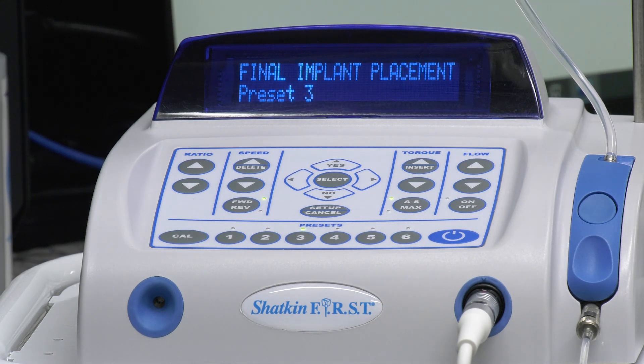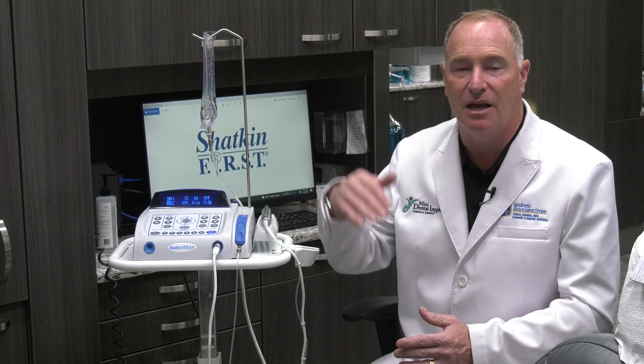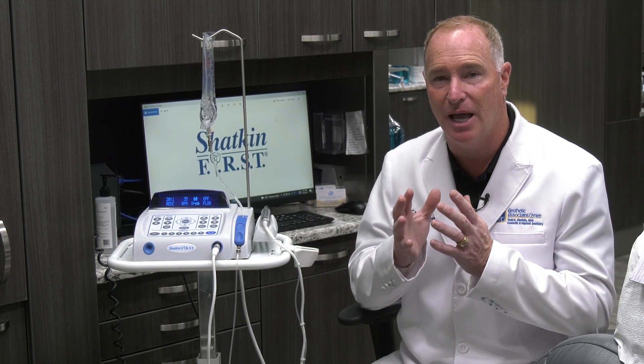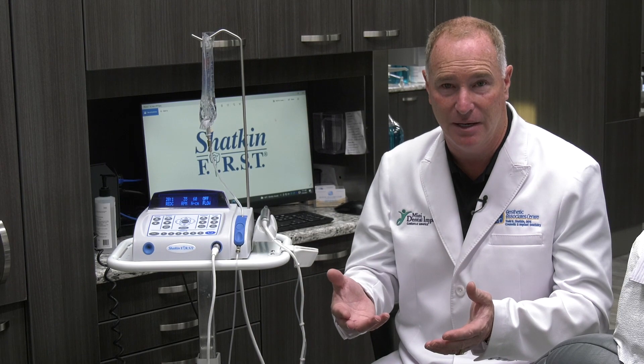Setting number three is our final implant placement setting. This setting is set to 60 newton centimeters of torque, which is at the upper range of the torque resistance we want. The maximum torque resistance we want is 70 newton centimeters. Beyond 70, the bone can be compressed too much and you can end up having osteonecrosis and lose the implant.